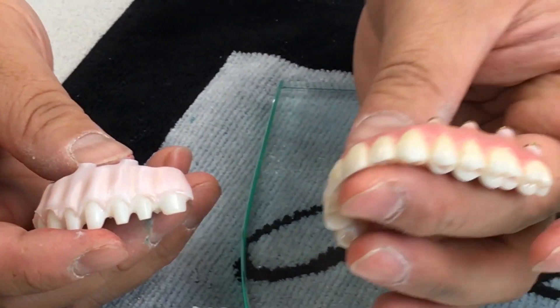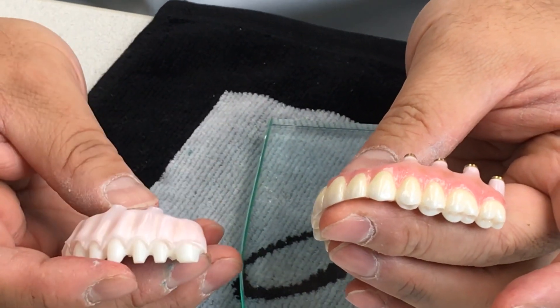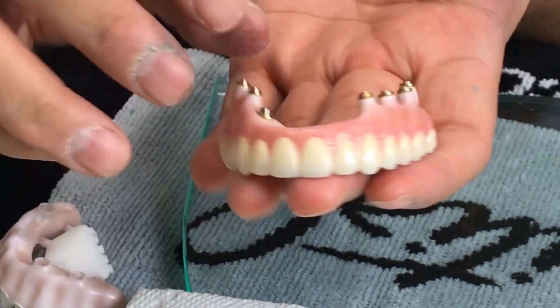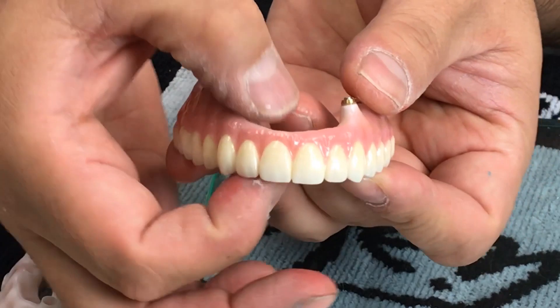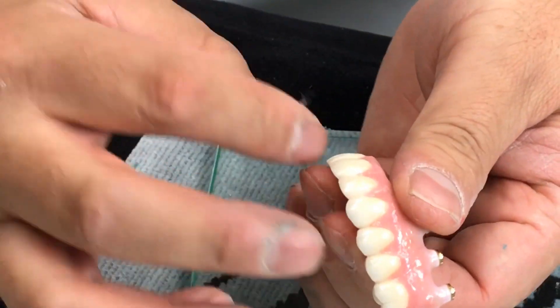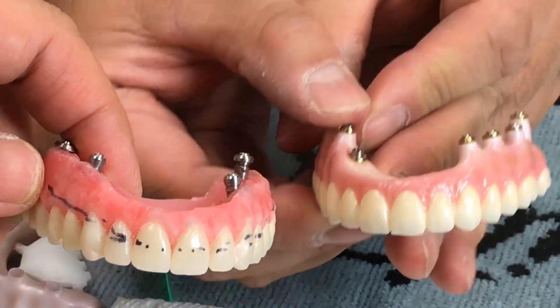This is the final case, and basically it was made in two pieces. The biggest problem with this implant case is it's very long, and the front anterior region is really short. Because of this, we have to make everything in two pieces.